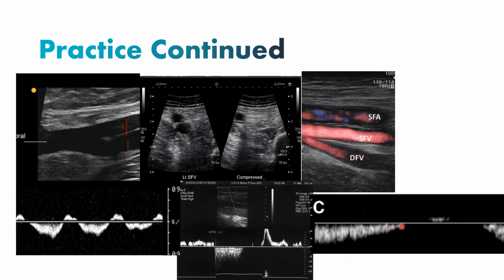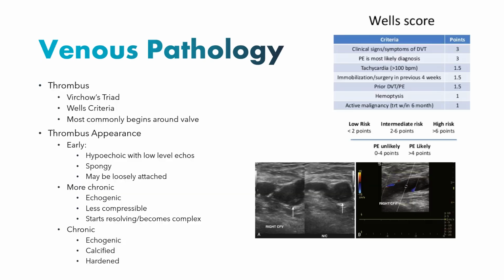They have the patient perform Valsalva. It cuts off blood flow with the exception of just a tiny bit of reversal, maybe a little bit of a valve issue there. And then as soon as they breathe, they're getting that full whoosh forward. So all of those would be significant indicators and good standard practices for evaluating the presence of a thrombus in the venous system.